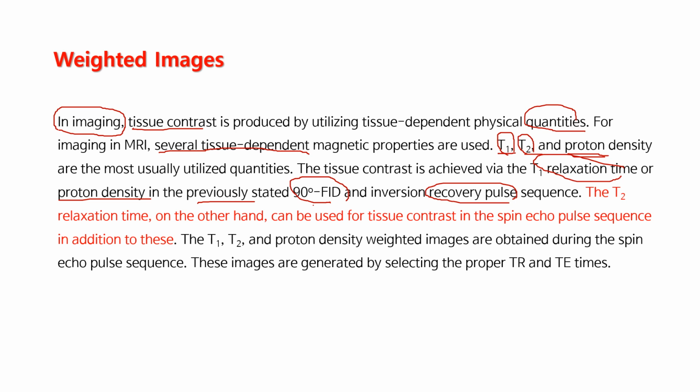And in that case, we saw that in these pulse sequences, we can get T1 weighted images or proton density images.